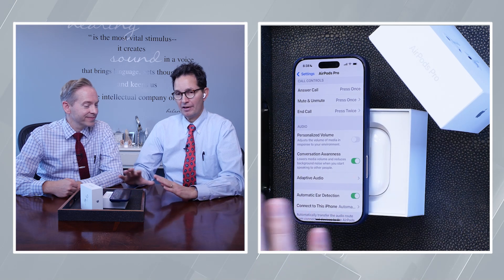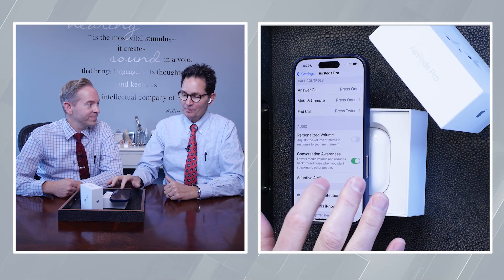It's actually not very hard. You do have to play around with the software because once you've taken a test, your system — the way it's programmed — it only wants to use that test because it's like, that's the most accurate. So if you want to override what you did with your iPhone hearing test, taken in the quiet of your own personal space, you need to know how to get there.